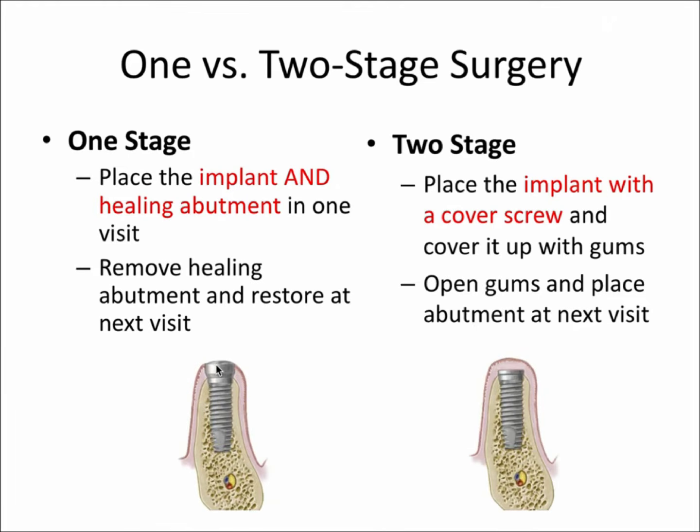And this could be either the temporary healing abutment shown here or that final abutment that we saw in the previous slides. So why would we do two-stage surgery? Because most patients would want to just have one surgery and be done with it. Well, two-stage can be beneficial for three main reasons I can think of.